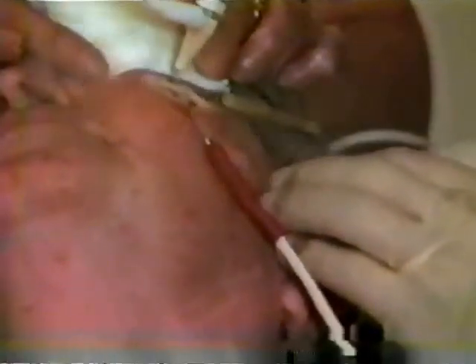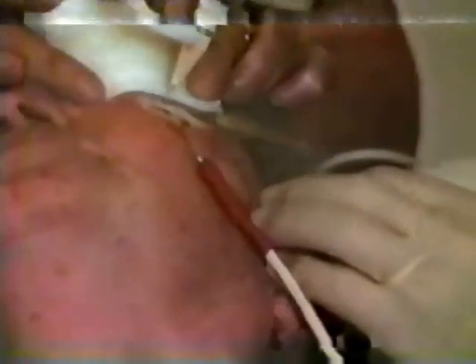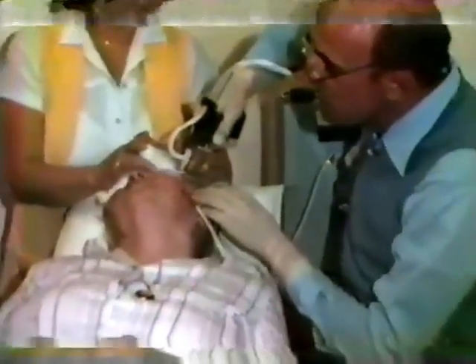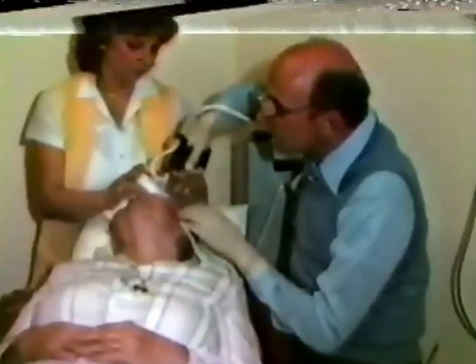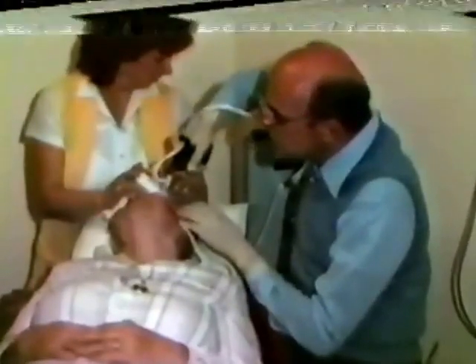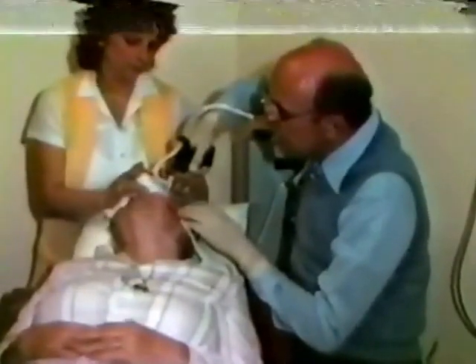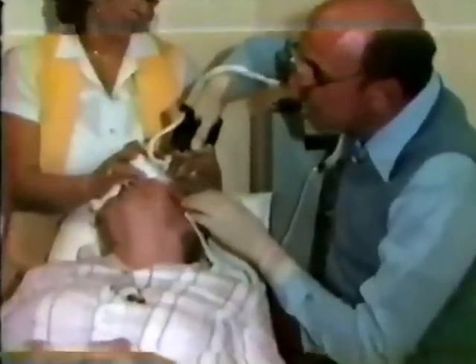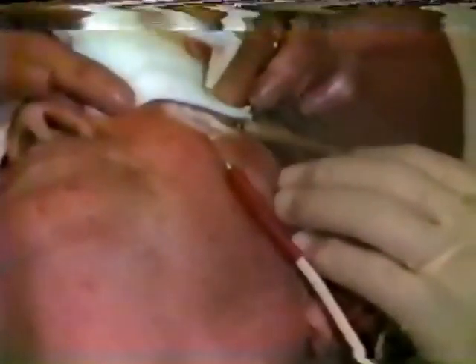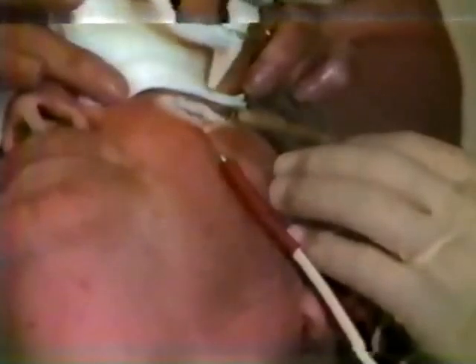I'm watching the time very carefully during this procedure because cryosurgeons such as myself must know the amount of time it takes to freeze these lesions and the amount of time it takes to allow them to thaw out in order to get maximum benefit. How cold are we now at this point? We're approximately 15 degrees below zero. 25 degrees below zero is adequate. So we get a better cure rate by simply freezing to about minus 40. We're halfway finished, Esther, with this freeze. How uncomfortable is it? It's not.